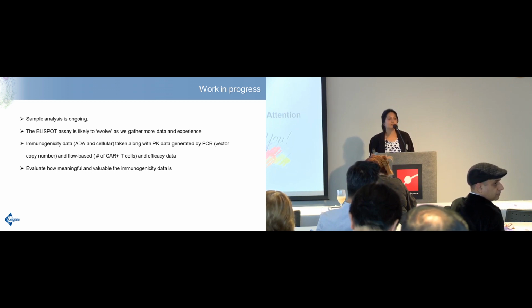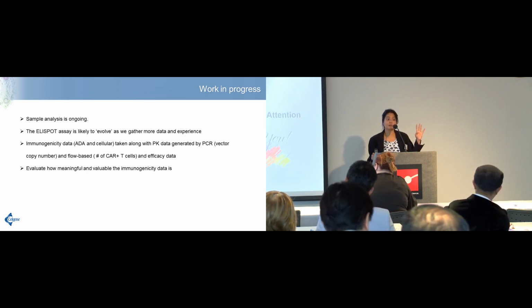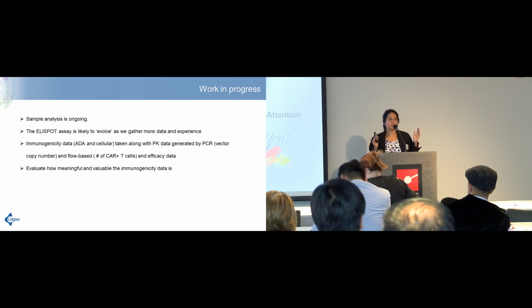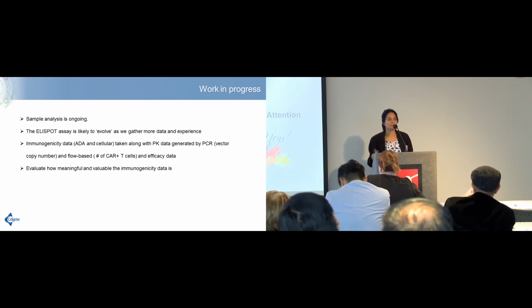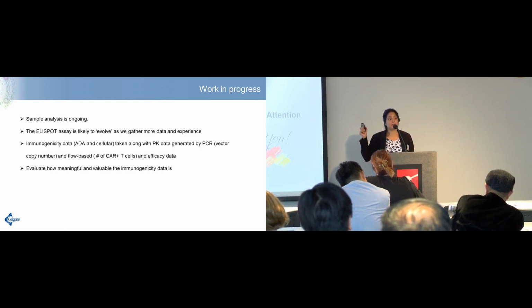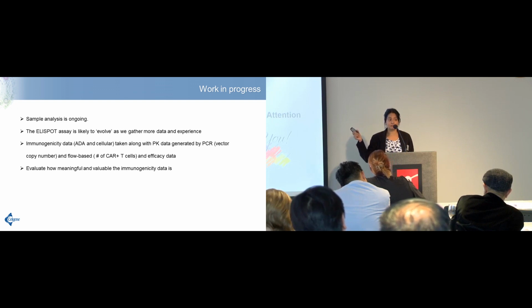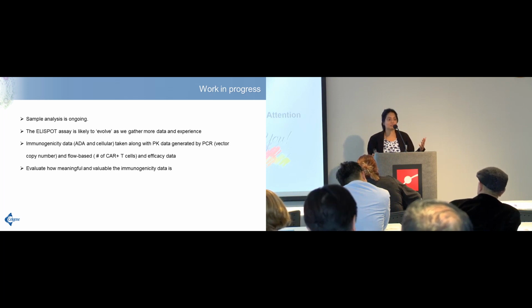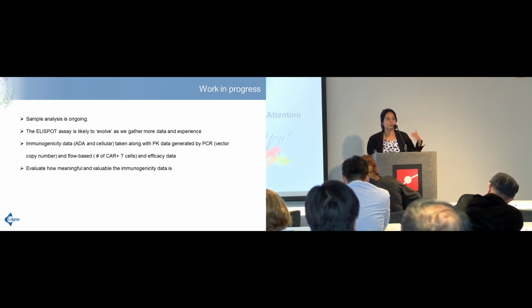Have you looked at, or have you thought about looking at basal reactivity? Yes. So we do collect a pre-dose sample, pre-infusion sample, and then we collect post-infusion as well. And so far, all our pre-infusion samples are negative based on the data set. We have data worth 20 patients right now. That's how much we have. But all 20 were negative based on our cut point established using patient serum, but not CAR-T, not our study serum. So disease state matrix purchased from a commercial vendor was used to determine the cut point, and that cut point's holding up so far.